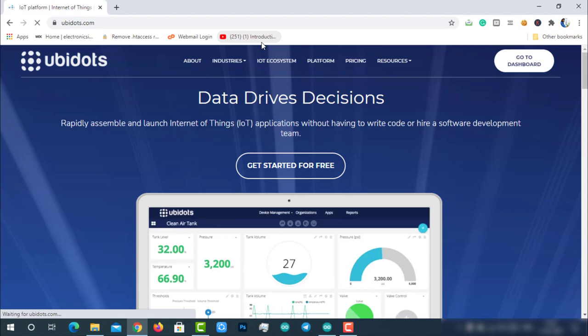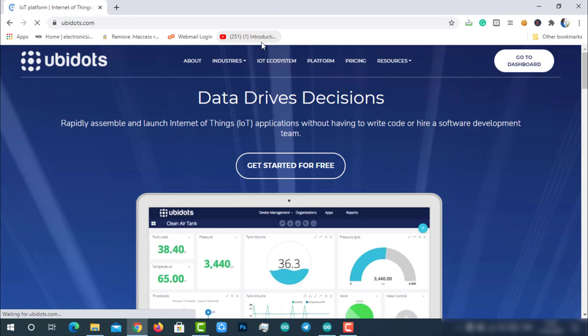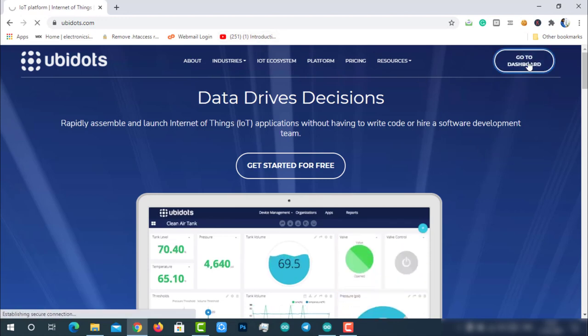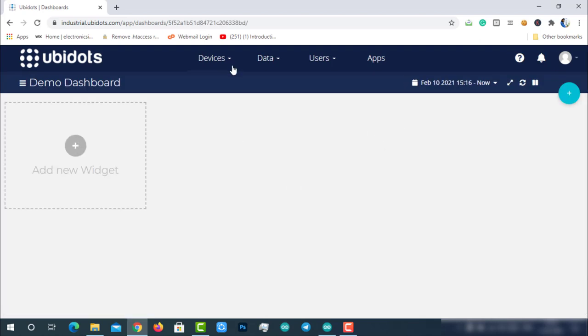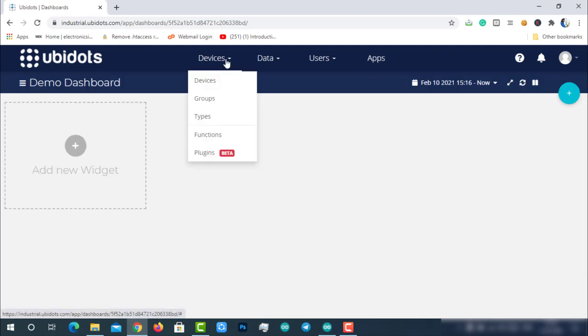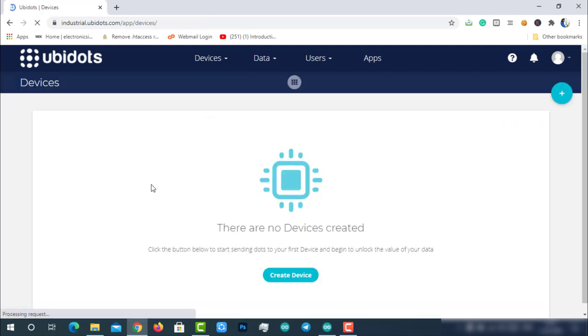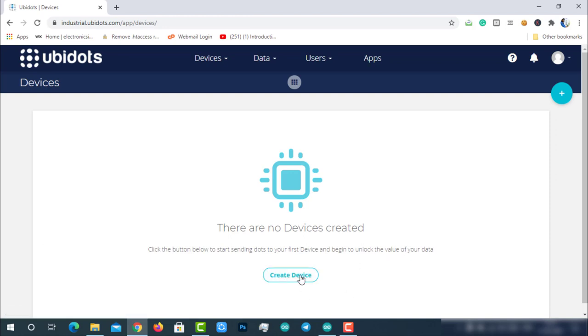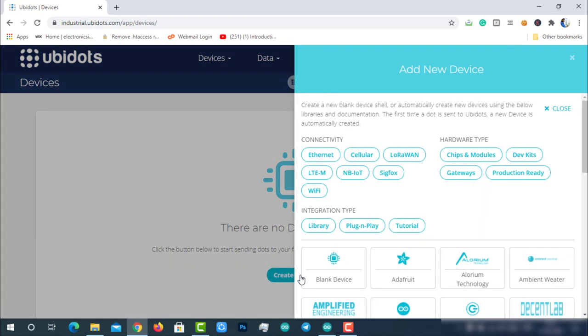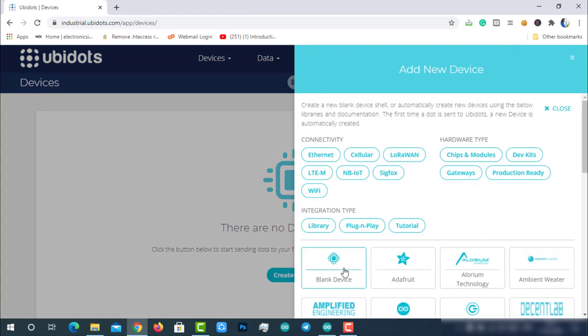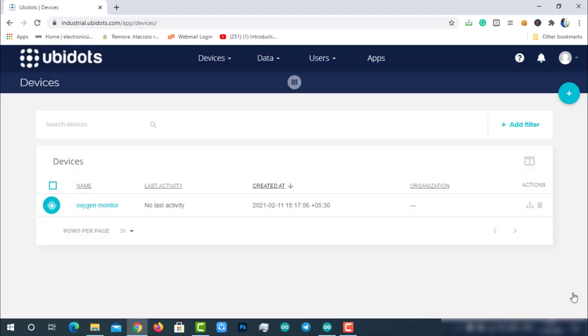Let's create a device in the Ubidots platform for our solution. Visit ubidots.com, go to dashboard, click on devices, create a new device, select a blank device, enter the name for the device and then click on the green tick mark to create the device. That's it, the device is successfully created.